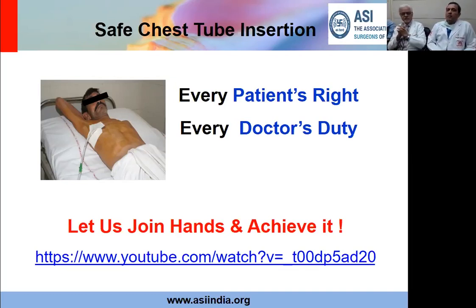Yeah. So, as a matter of routine, there is no need for putting suction in every patient, whether the patient has pneumothorax or pleural effusion or hemopneumothorax. You put a chest tube, ensure that the bottle is put properly, ensure that there is no kinking of the chest tube. Sometimes your stitch may be tight and there could be some narrowing here. Sometimes when you take this loop and you do the dressing, the angulation may be such that there is some kind of an obstruction occurring. This prevents complete egress of fluid and air and leads to persistence of pneumothorax or hemothorax.